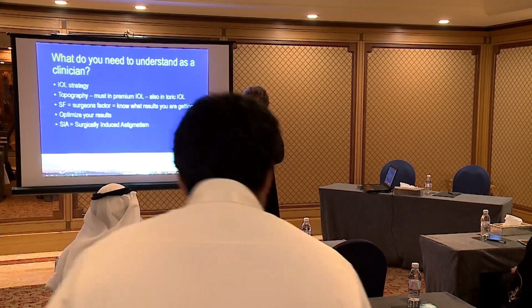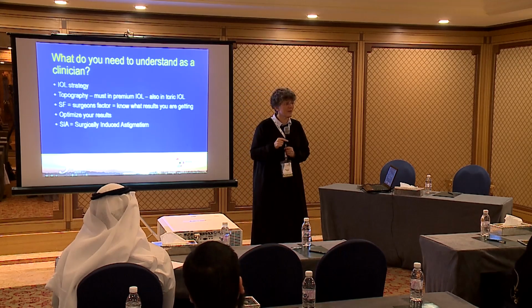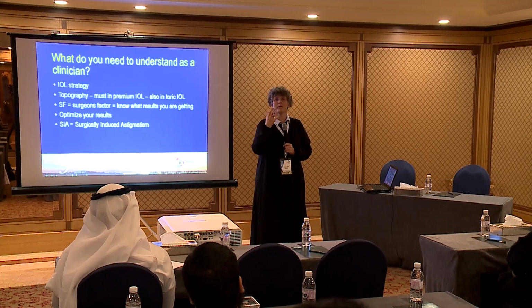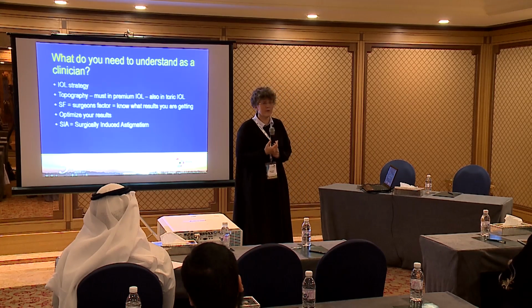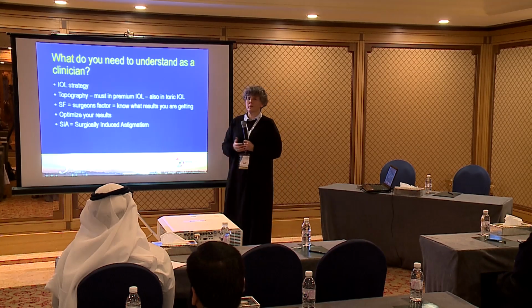But then in my private practice, I'm the boss. We do topography on everyone. I will not do any IOL calculation without seeing a topography, because for me it's an integral part of making a decision what kind of lens I put in. Okay? Now, the surgeon's factor.